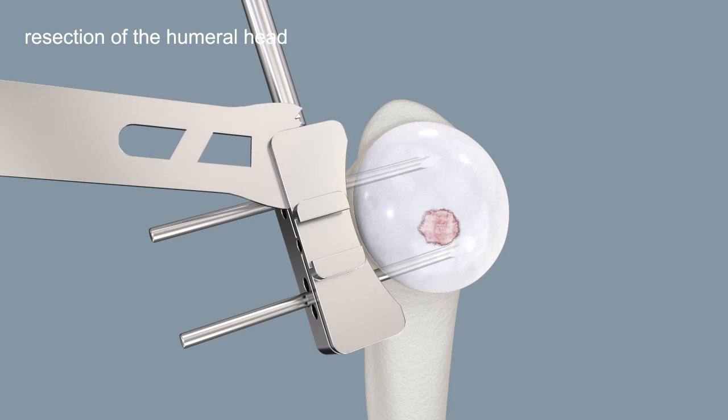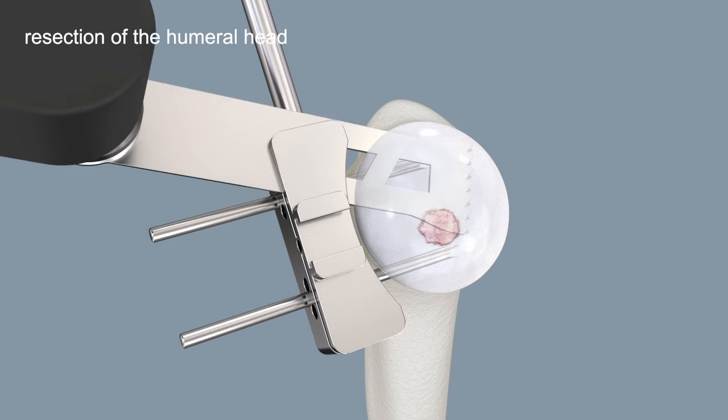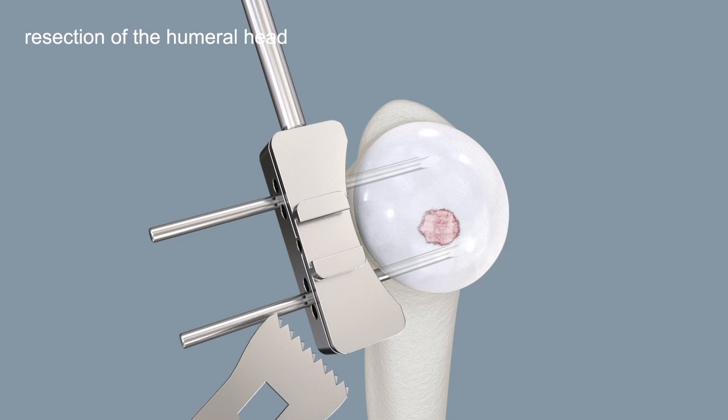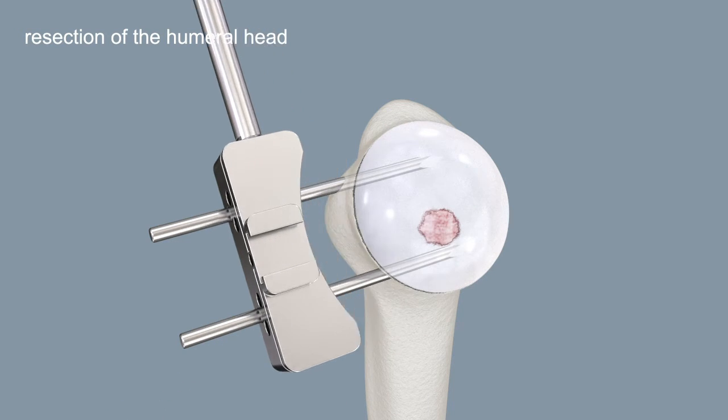Resect the humeral head using a saw blade. The resection should precisely correspond to the plane of the anatomical neck. Remove all the instruments.